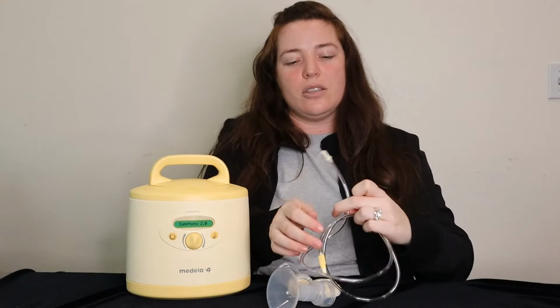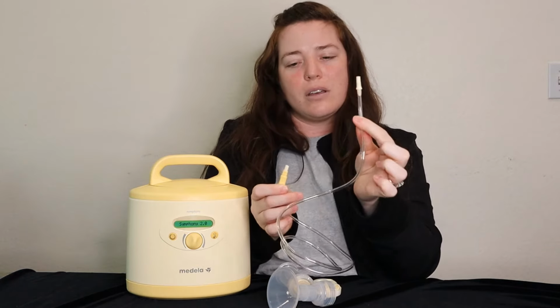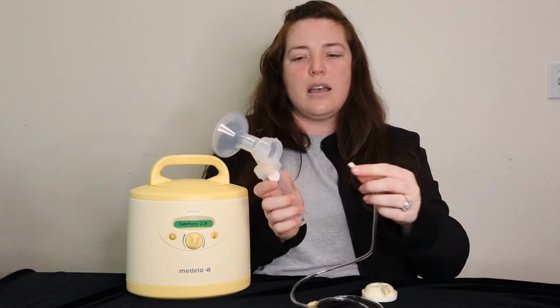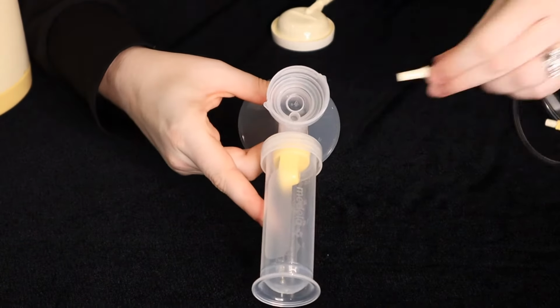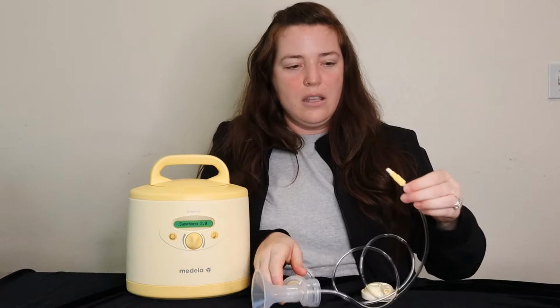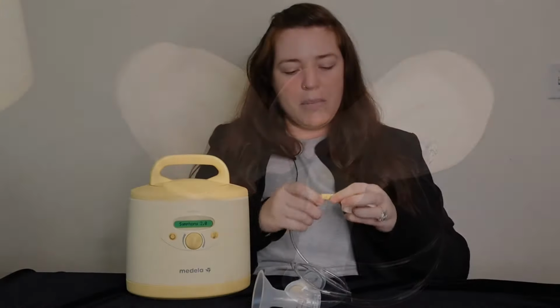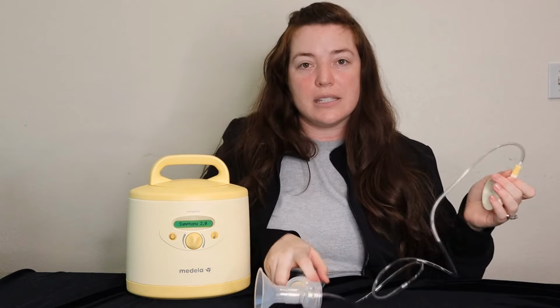On your tubing, you have two different sides. So I have a smaller side. That one's going to go to the bottle end, and this bigger side that has the darker yellow, that's going to go on the membrane for the pump. Smaller end, I'm going to go ahead and put in here. There's a small little hole for it. Just push it in, make sure that's good and tight, and then take this bigger one with the darker yellow. It's actually shaped like a triangle, so it fits right in here really good. And make sure it gets good and flush. You want to make sure all your parts are nice and tight so that you have a good seal.